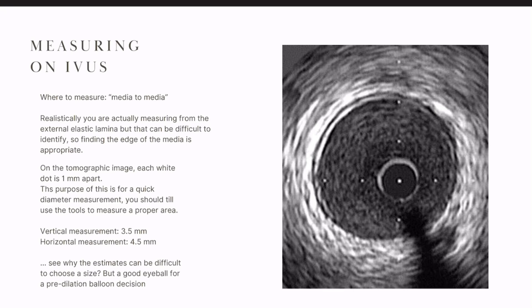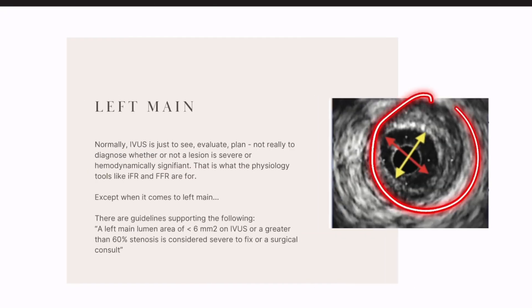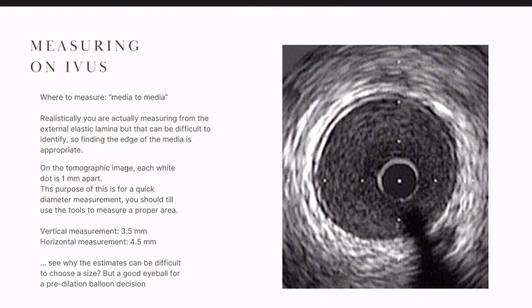In order to measure on IVUS, you need to understand what the layers are because where you're measuring is important. The way you measure is media to media — realistically the external elastic lamina, but you're not always going to be able to differentiate that. When first starting, I teach you to use the outside of the media or on the media itself. Just make sure you're not accidentally measuring the intima, because if the intima is here and the media is out here, that is a very big difference in measurement. Always look for that black line — that's what you measure against.